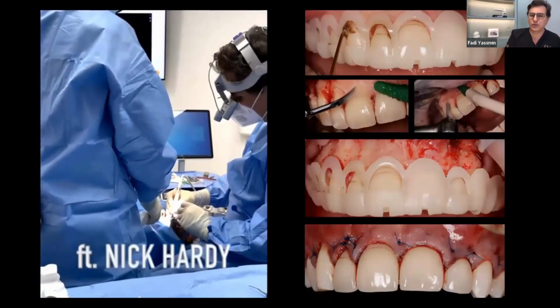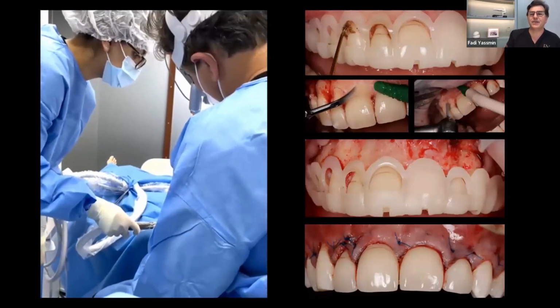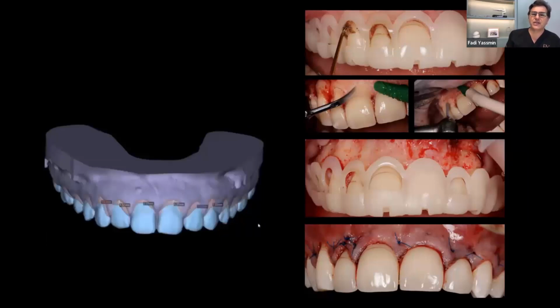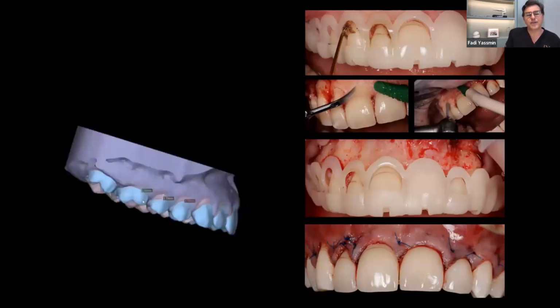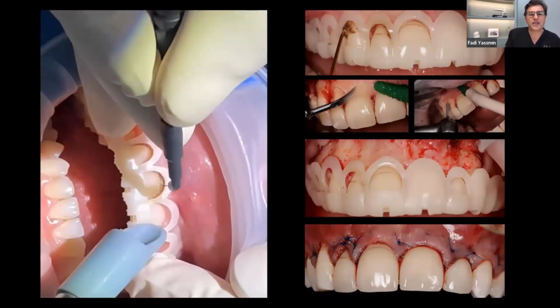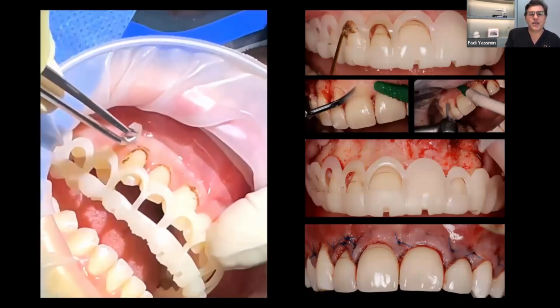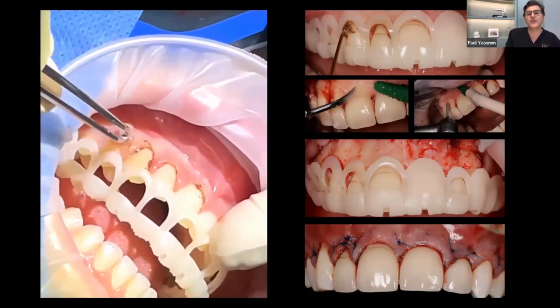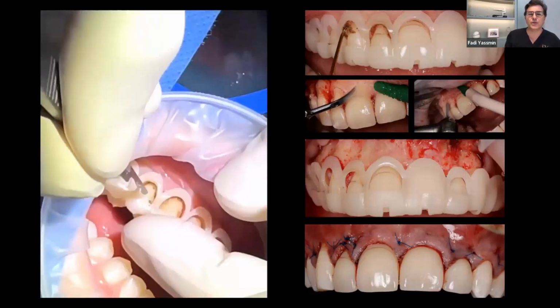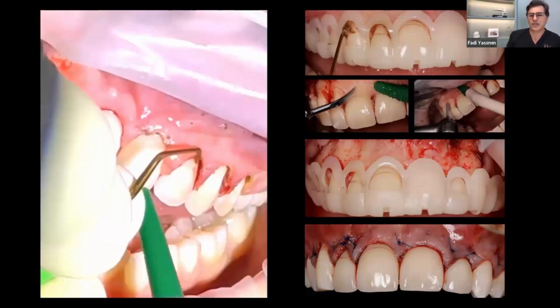The case on the left was just purely a soft tissue guide. I didn't tape the case on the right, but it will just give you an idea, except the case on the right, which is the previous one I showed you, shows just how we use the Perio guide. You can see in the video, this particular case was post-ortho from many years ago, maxillary excess, and it was basically just getting the gum positioned and using the ideal gum position, using digital smile design and using the Perio guide to recontour the bone. And you can see the first stage is the soft tissue component using the actual guide.